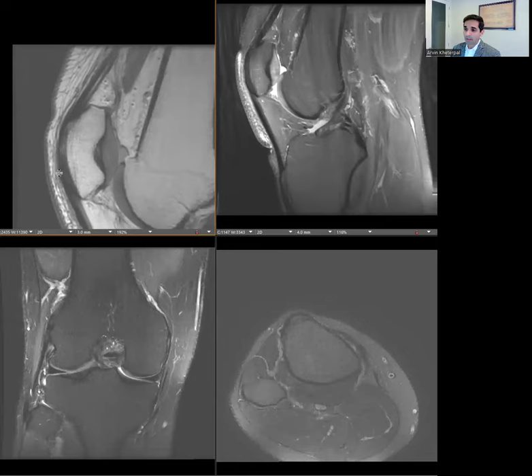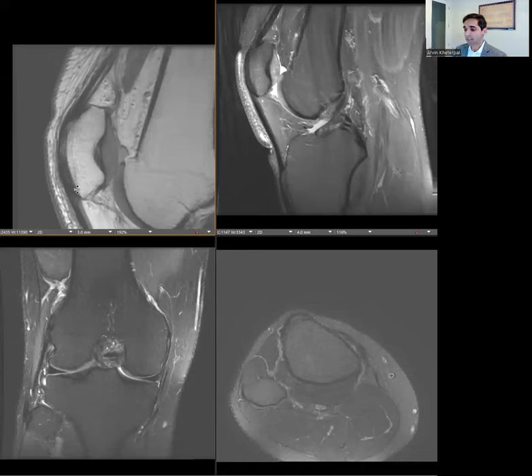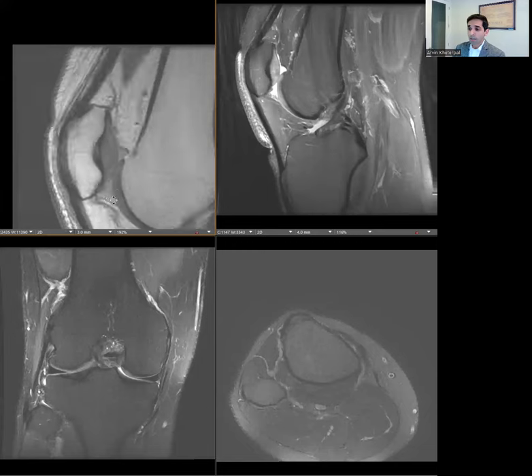The patella is a sesamoid, and anteriorly it's draped in the quadriceps tendon. A very thin portion of the rectus femoris comes anterior along the patella and envelops it — that portion is called the prepatellar quadriceps continuation, which you may see in some papers and textbooks. That actually continues to our patellar tendon down below.